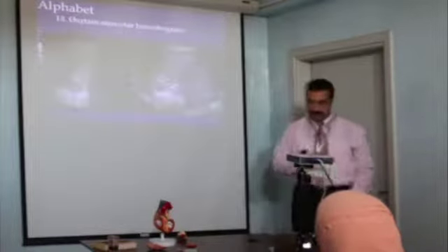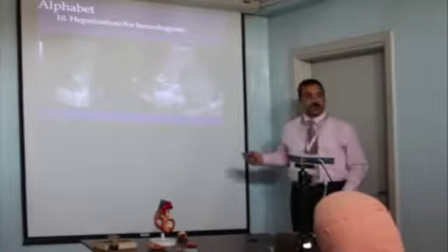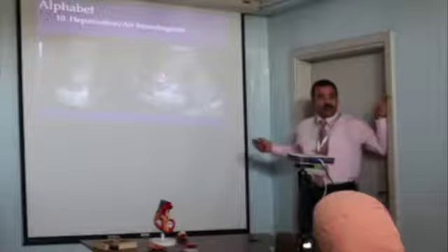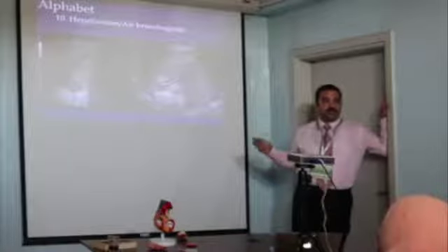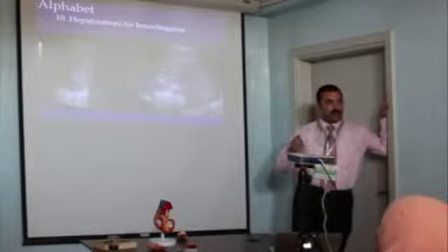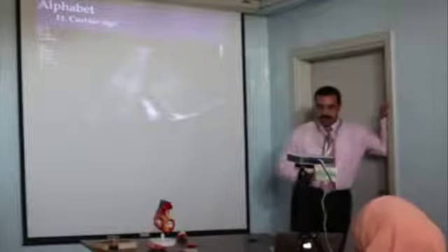Again. Okay. If you find the lung tissue becomes like liver or spleen tissue, there's no air anymore in the lung. You shouldn't see this in normal individuals, because air prevents ultrasound from going here. If it's tissue-like, that means consolidation or collapse or atelectasis. There's abnormal morphology. How do we discriminate between them? If I find these threads and there is mobility in these threads, we call it dynamic air bronchogram. Dynamic air bronchogram is indicative of pneumonia. Okay? Happy? Curtain sign.